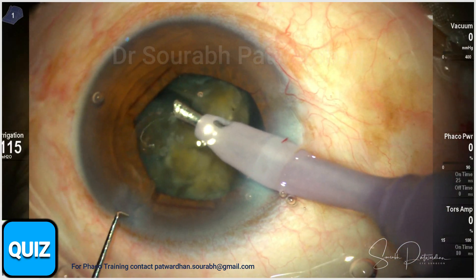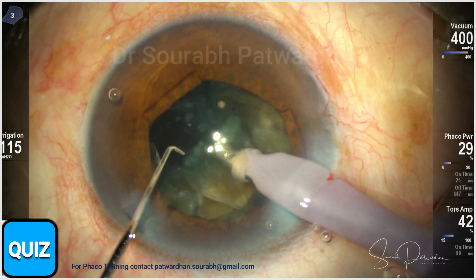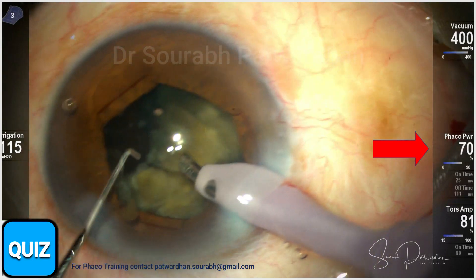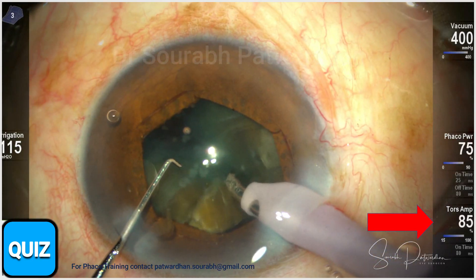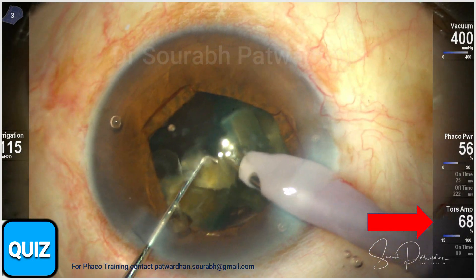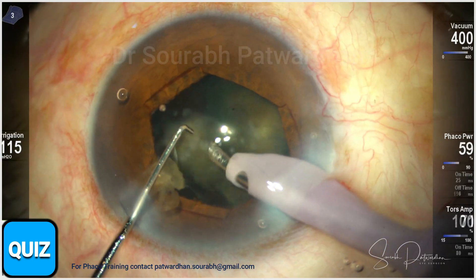Then I continue for the second hemi nucleus. I use 90% of the longitudinal phaco power with 25 milliseconds of burst, and 100% torsional with 80 milliseconds of burst. This avoids any corneal wound burn.